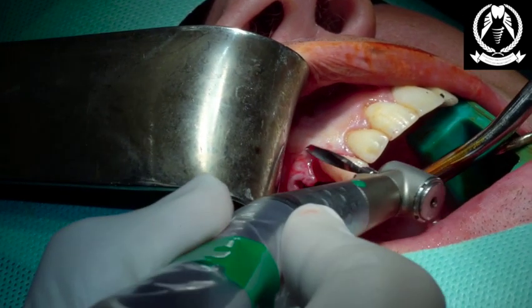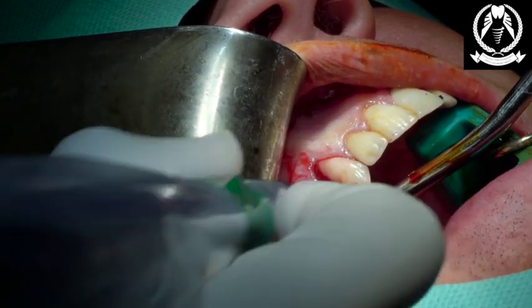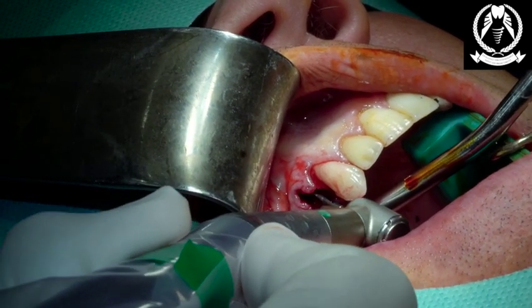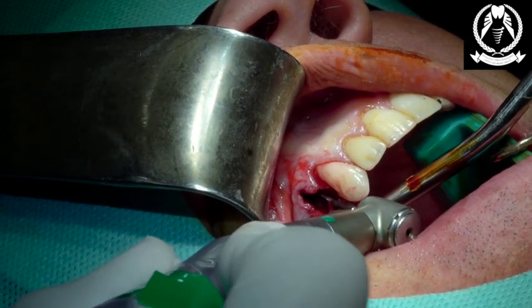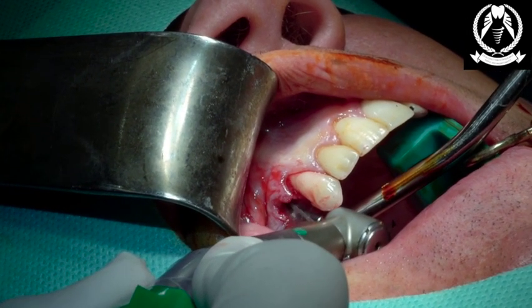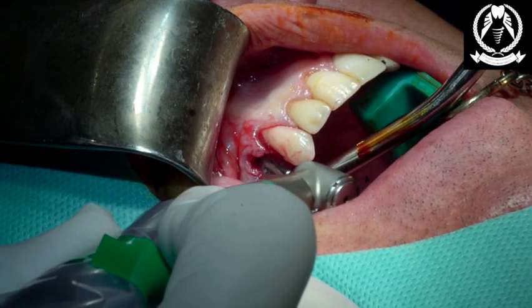Now, that's the root of your 3. The root of this is slightly mesially inclined from the CT scan. You can see my drill going to the apex. What we want to do is go slightly behind that, and then just start our drill, just to feel through that bone, just a couple of millimeters.